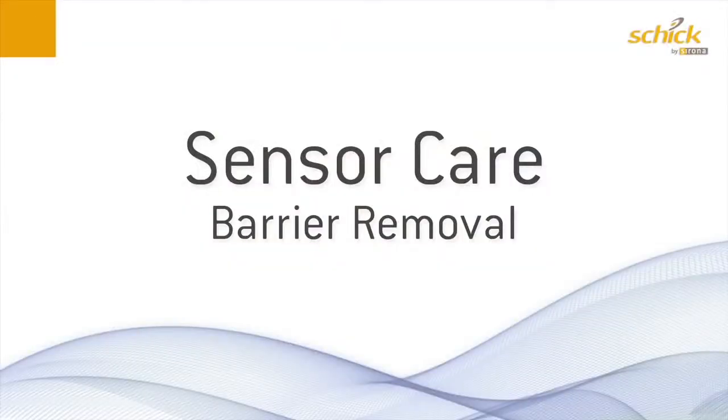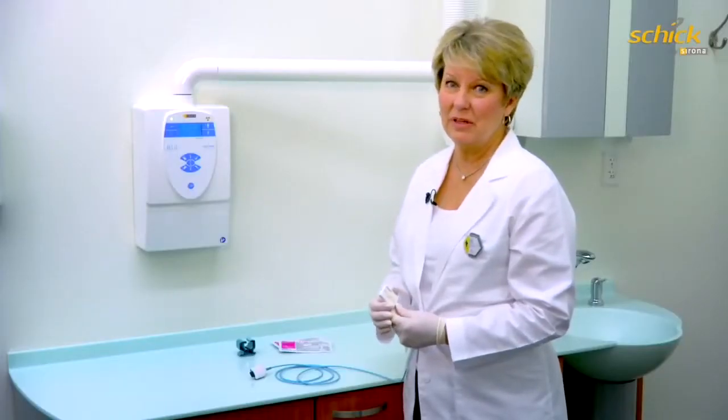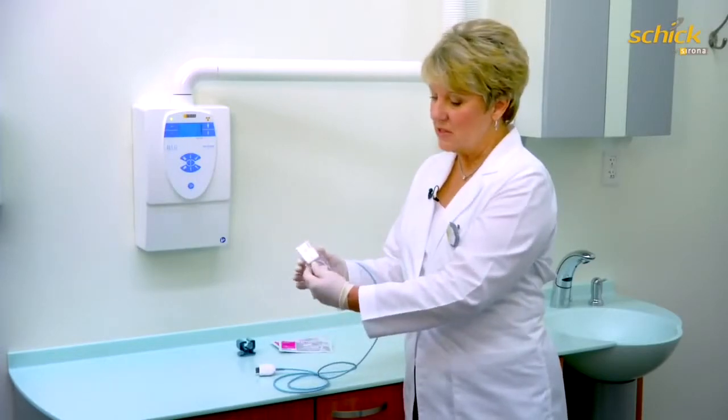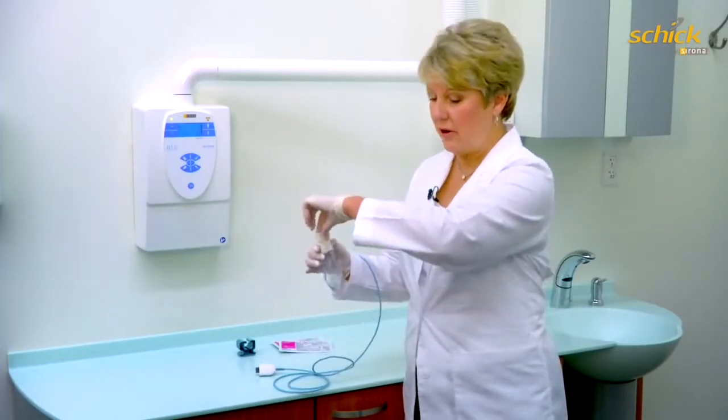When removing the barrier from the sensor, we want to make sure that you avoid pulling on the cable. Wrap the cable around your arm, hold the sensor, and pinch the barrier off at the top.